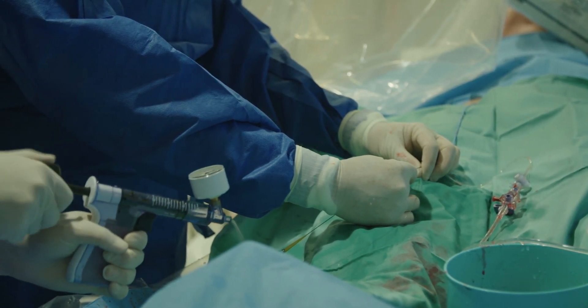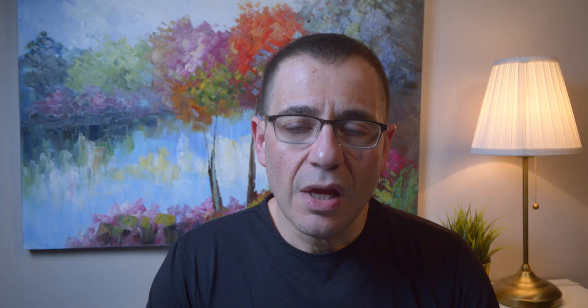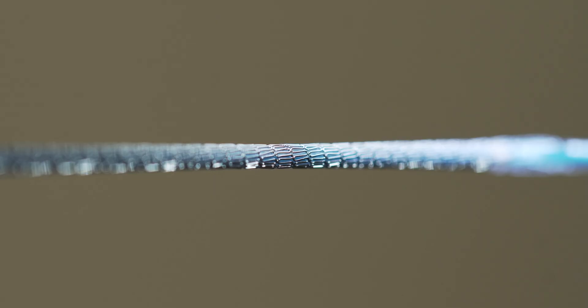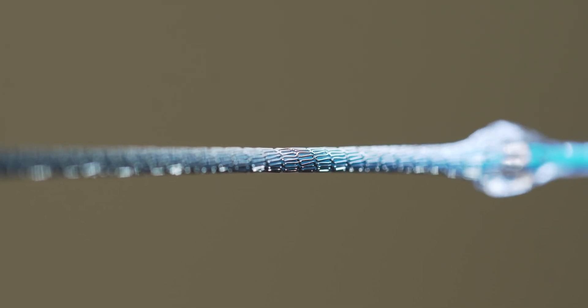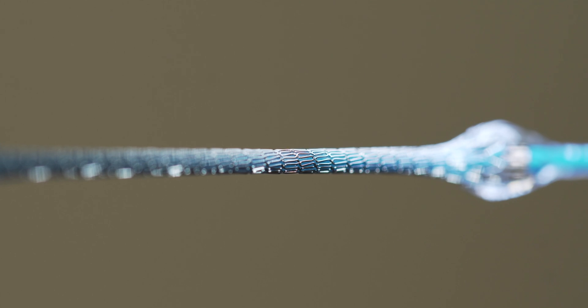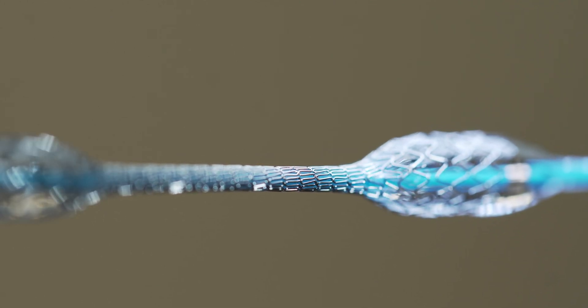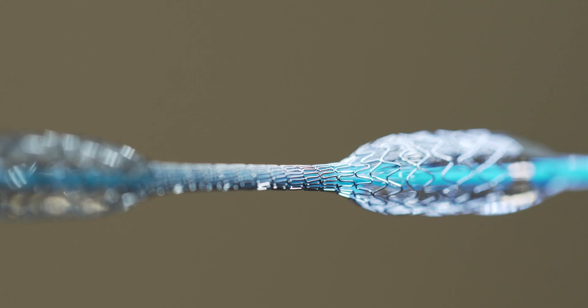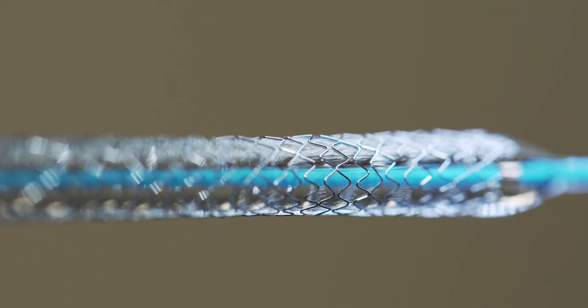We usually inflate a balloon up to 12, 14, or 16 atmospheres. The stent is placed in a similar fashion, positioned inside the blockage, and then we use this indeflator to dilate from outside and inflate the balloon and stent. The stent then grabs onto the inside of the artery and stays there.